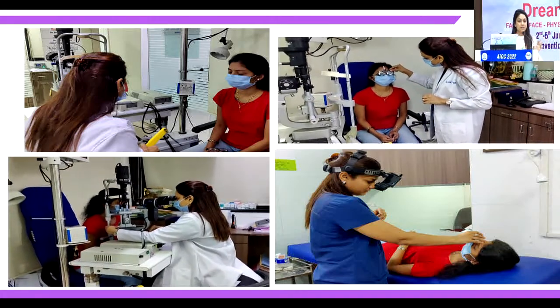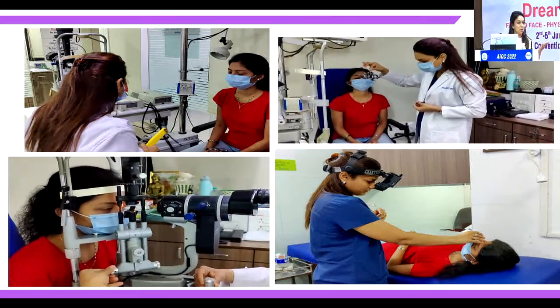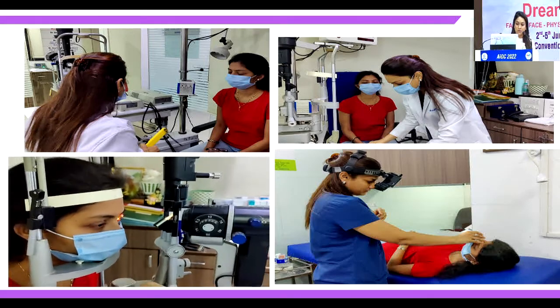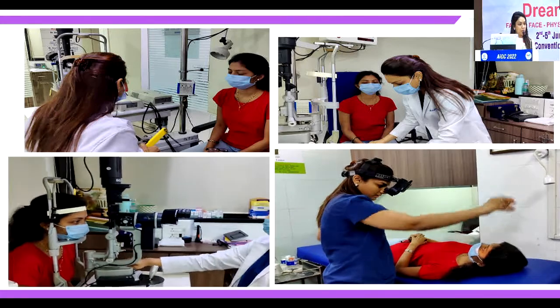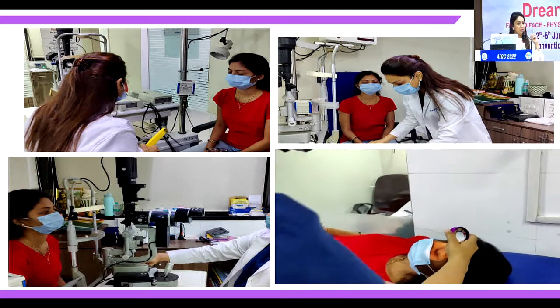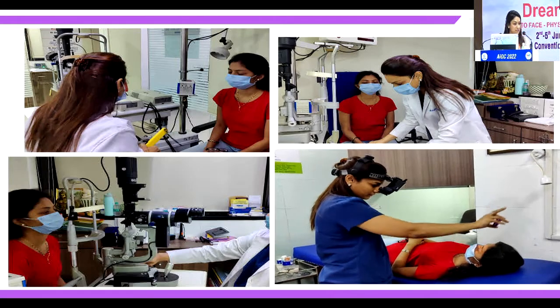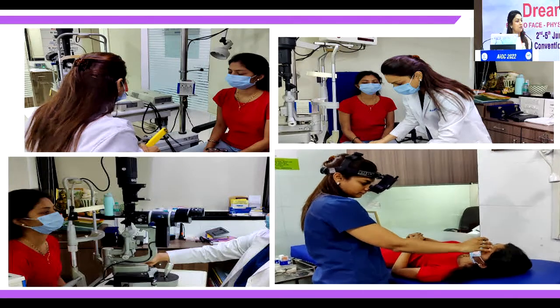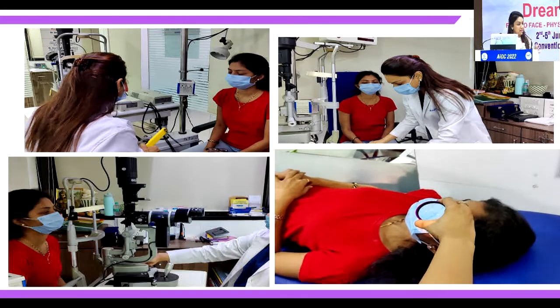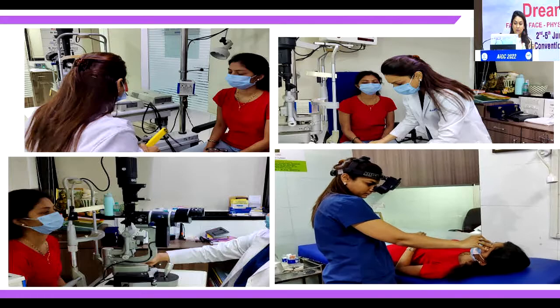A good slit lamp examination to rule out if there's any cataract is one of the very important things to document. Of course, along with the cornea, how clear it is, and the anterior chamber and other details of the eye. Very, very, very important in refractive as well, especially when we are dealing with phakic IOLs and high refractive error, is a detailed retina examination. If you're not very comfortable yourself, go ahead and refer the patient to a retina surgeon, which I usually do in my clinical practice. If the refractive error is more than -8, before going ahead with any kind of refractive procedure, I take a retina opinion on paper.